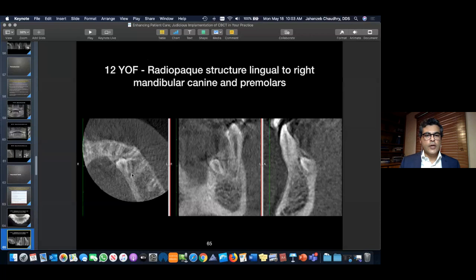So our surgeon was successfully able to extract these teeth. There were actually two of them, and they were in very close contact with the canine especially, and also the first premolar. But in this case, these teeth could not have been moved orthodontically if both of these supernumerary teeth were not extracted. Okay, go back to the full screen mode.